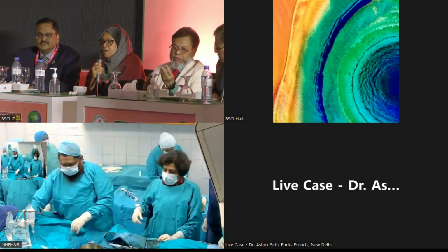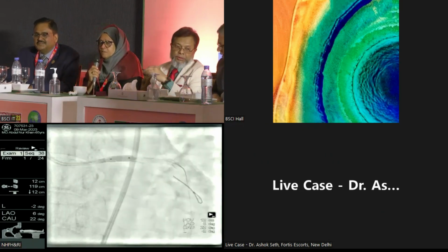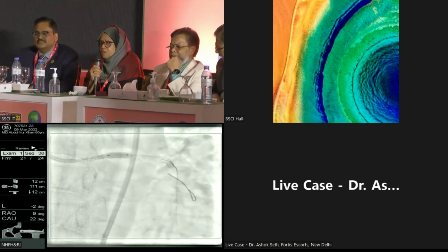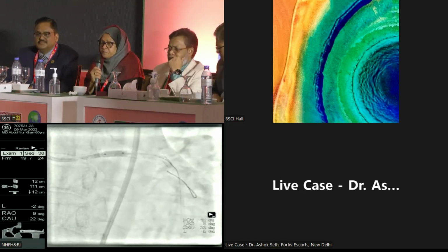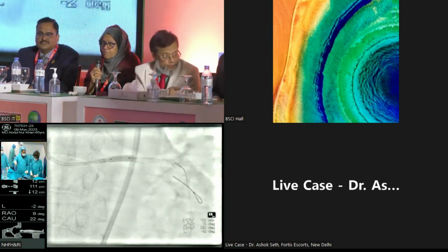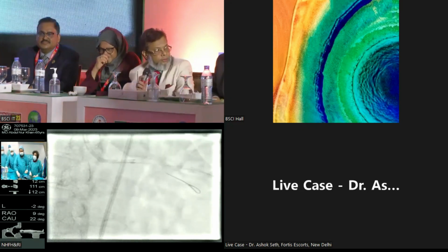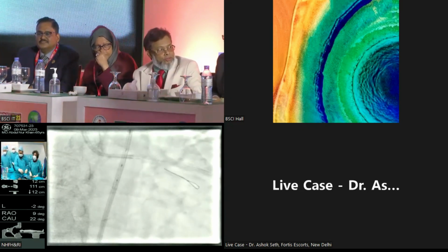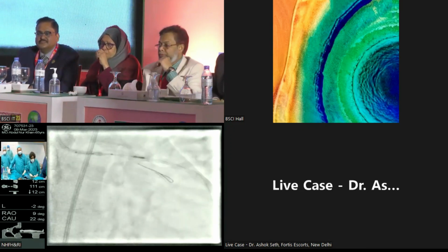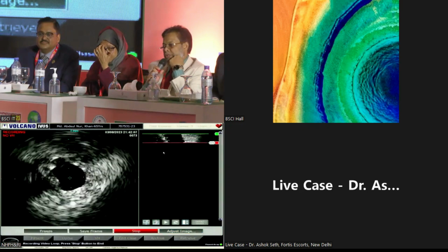So now we're taking the IVUS and it'll take us a minute or so. So if you can stay with us for a minute, we can show you the IVUS. So the IVUS catheter, so we'll just show you the bifurcation maybe. Can we go live? So there was a lot of calcium. Now we are seeing the IVUS.